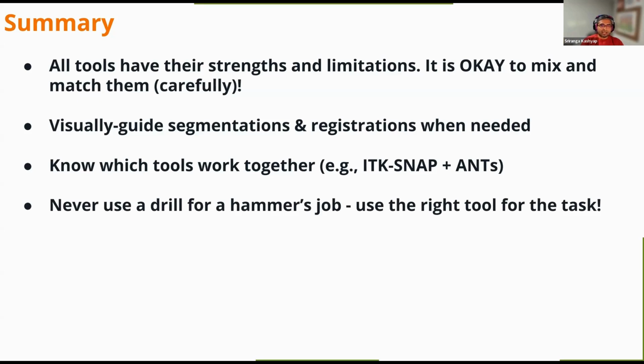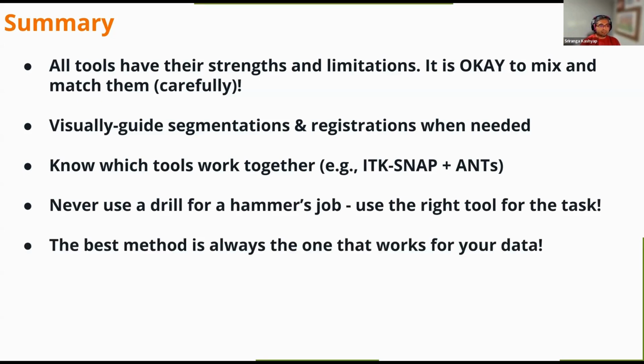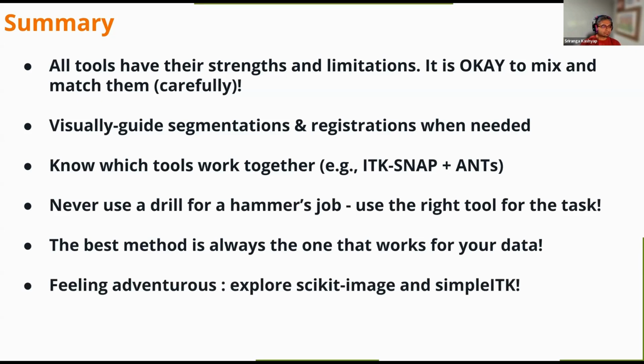Never use a drill for a hammer's job. Use the right tool for the task. If something is not working, maybe it's the tool. Switch, see if another tool can do the job better. Again, I do not recommend one way over the other. The best method is the one that works for your data.